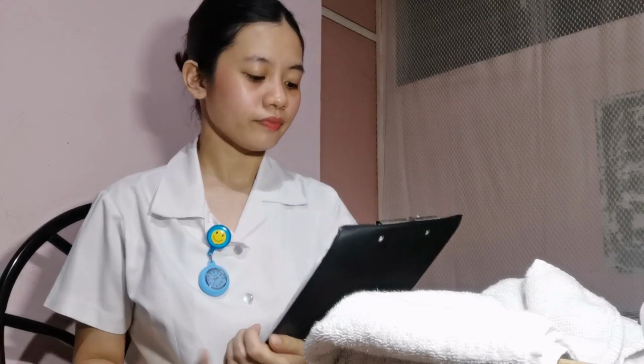Next is evaluation. Ask yourself if the results are within the normal range. Is there any alteration in the readings or the findings since the last measurement? Or is there any considerable unexplained difference between these readings and the former reading?